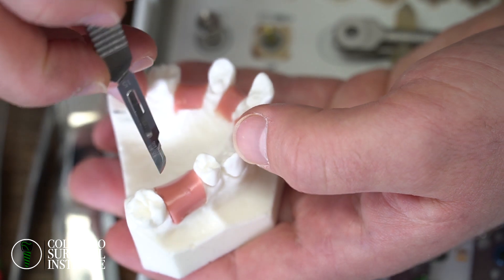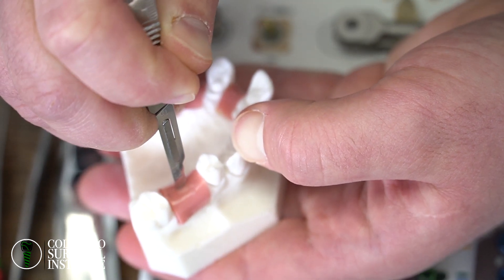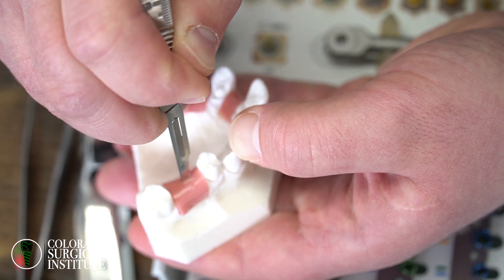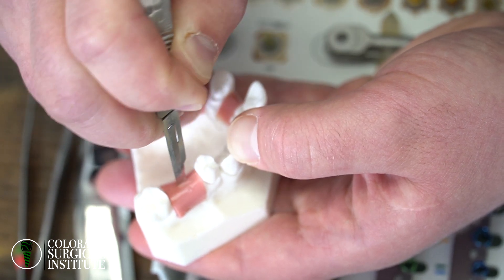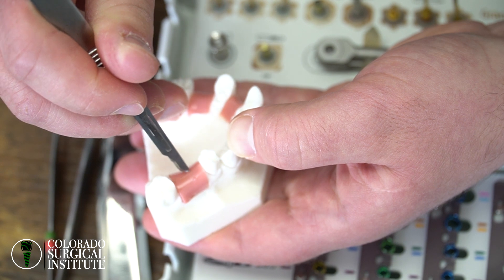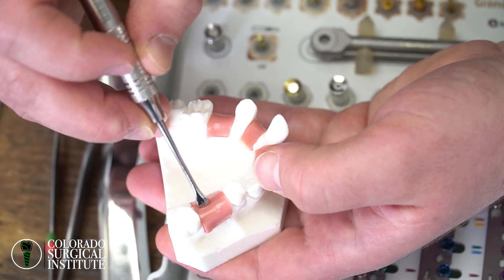So with my incisions, you're going to go lingualized right here, dig in until you hit bone very firmly, and then move back towards the other tooth. After that, I turn my 15 blade upwards and go right against the bone. Then I retrace the incision again, because what you're doing is going through the periosteum and scraping it away from the bone. If you only go through once, when you try to reflect, some periosteum will remain attached to the bone, creating a partial-thickness flap and causing the patient a lot more post-operative pain.